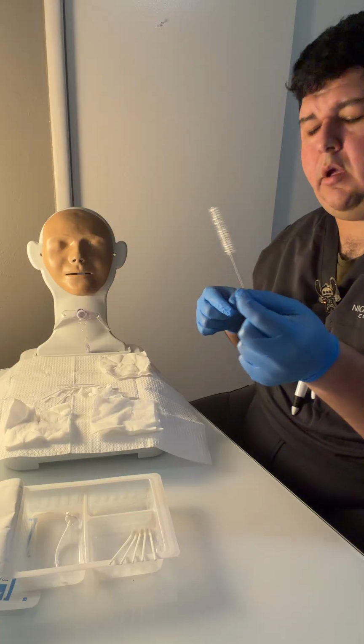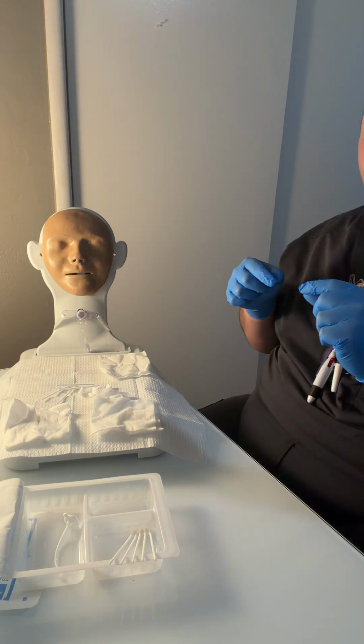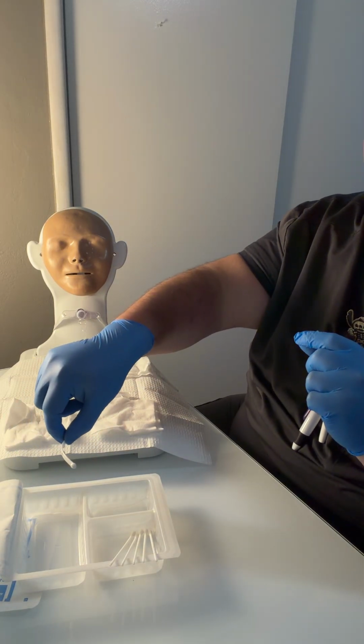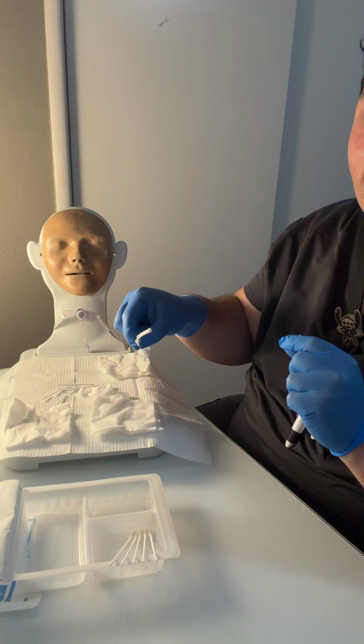Okay, I can discard that. Okay, I'm going to pull out, and then I'm going to dry it or let it dry.